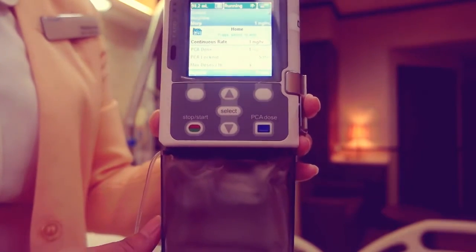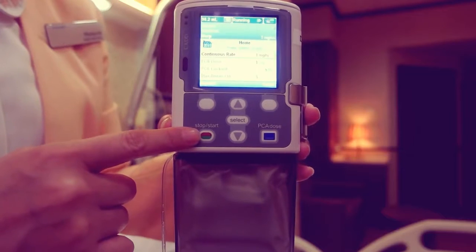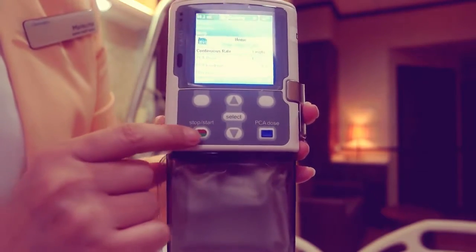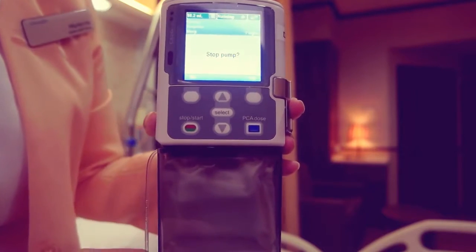First, stop the pump by pressing the stop start key. Stop pump displays. Press yes.